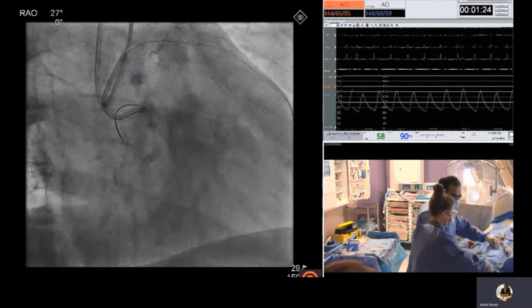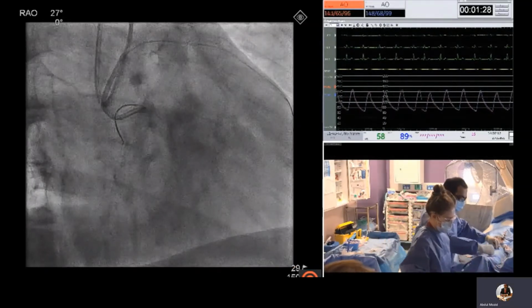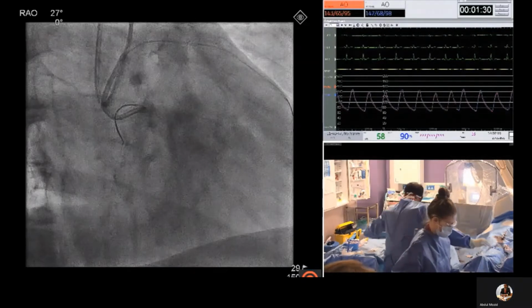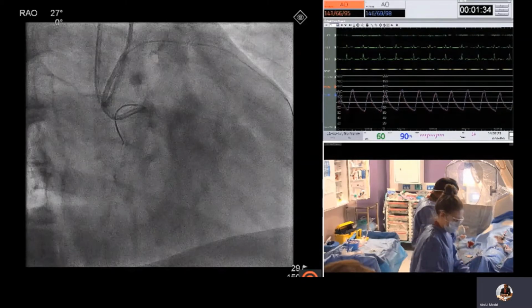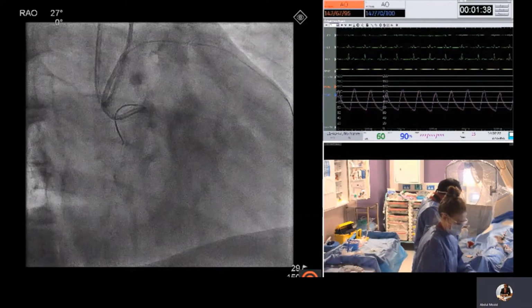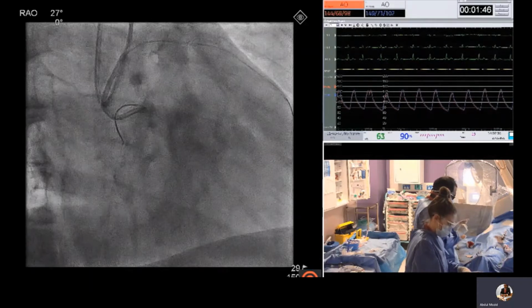We were able to deliver this to the proximal cap and attempted to wire this initially with a Pilot 200 wire, which is a polymer jacket wire of medium tip load.